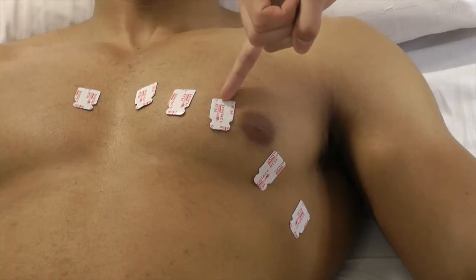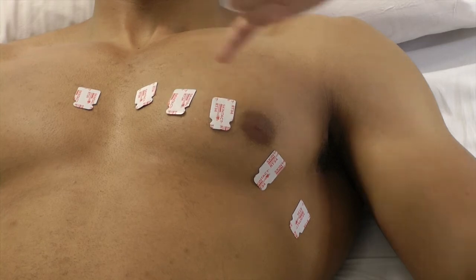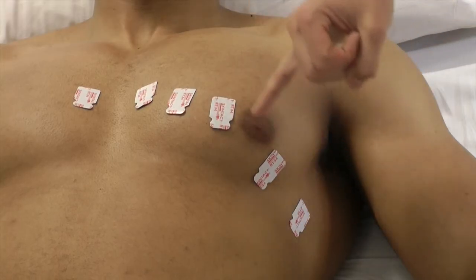Chest lead V3 needs to be between chest lead V2 and V4. Chest lead V5 is positioned between chest lead V4 and V6.